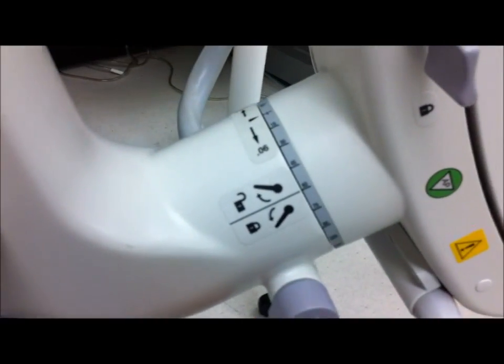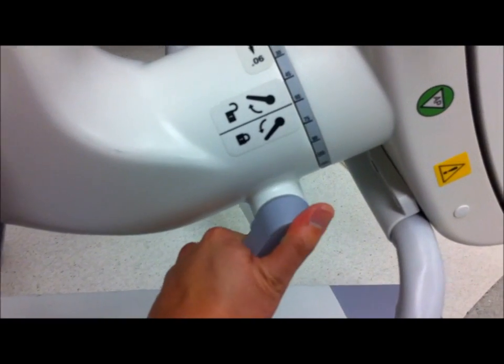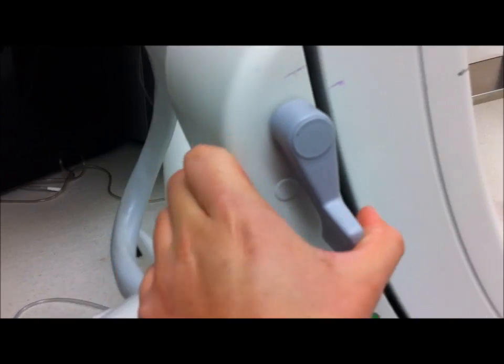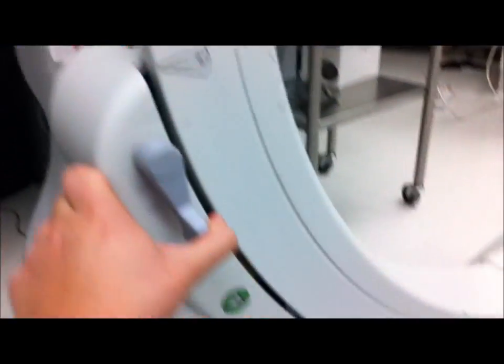Here is another tilt function. This kind of gives you an oblique and a tilt at the exact same time. So you lift it up and you can tilt the machine. And here is the standard AP lateral, so you can turn the C up and down as needed.